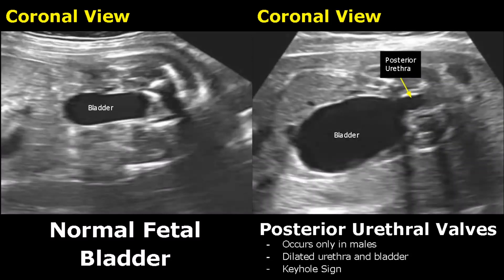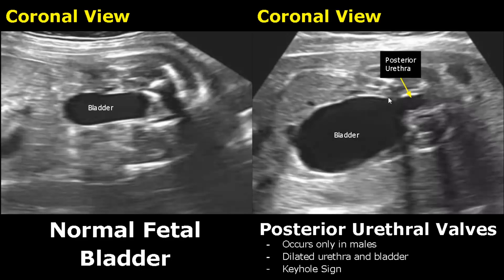In posterior urethral valves, membranes form in the urethra which cause the posterior urethra and the bladder to become dilated. This only occurs in males, and this appearance has a special name known as the keyhole sign.